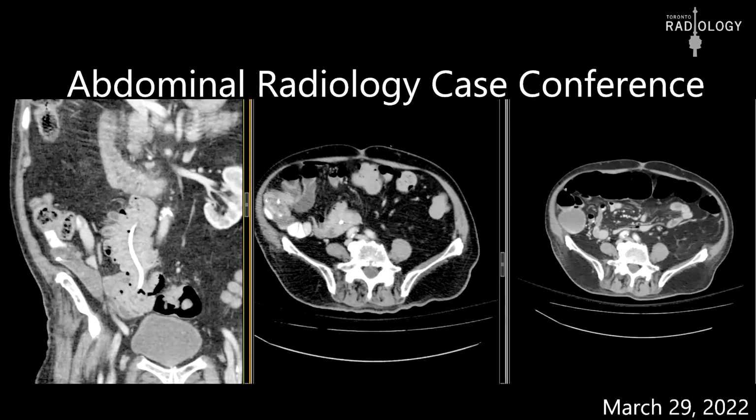This is such a cool case. I don't know if we just don't use them as much. I've never seen one like this. I'm going to look, but I've never even heard of a Duodopa tube. So I wonder if it's just less commonly placed in our hospital. Yeah, I had never heard about this before I saw this case either. When I was looking at it in the middle of the night, I had no idea what Duodopa was. So I had to read all about that to understand what the whole thing was.